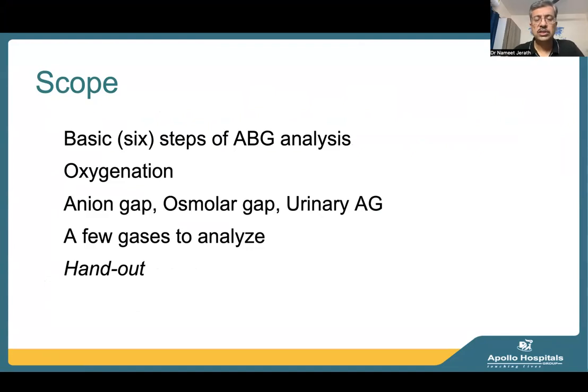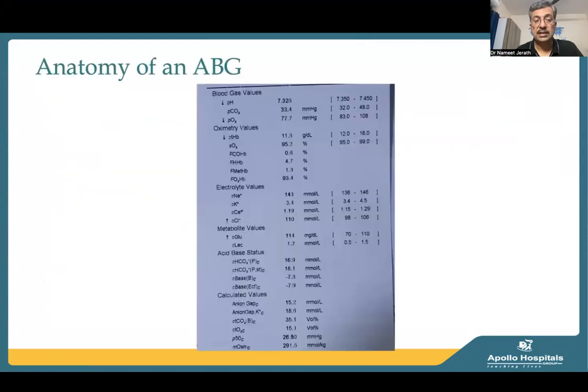We'll talk about oxygenation, a bit about the anion gap and osmolar gaps and urinary anion gap. We will do a few exercises to use these steps of blood gas analysis, and we'll end up giving you a handout about blood gas analysis.